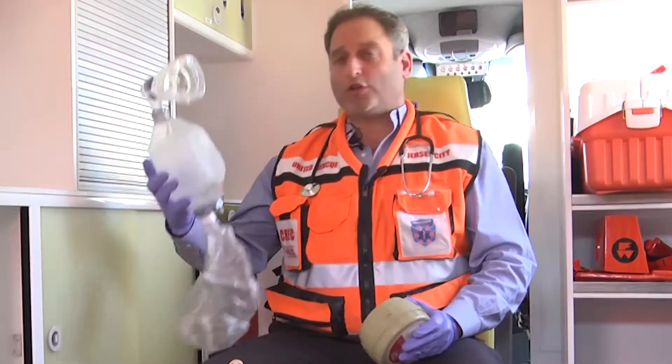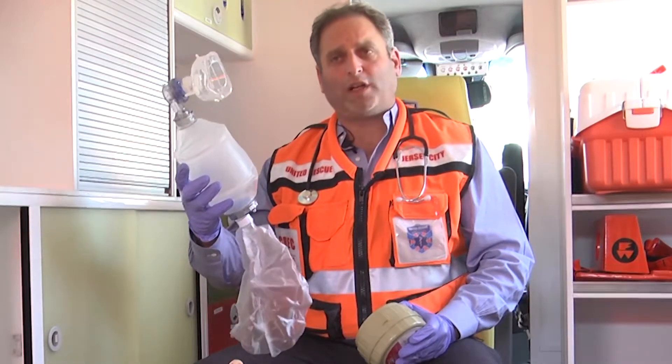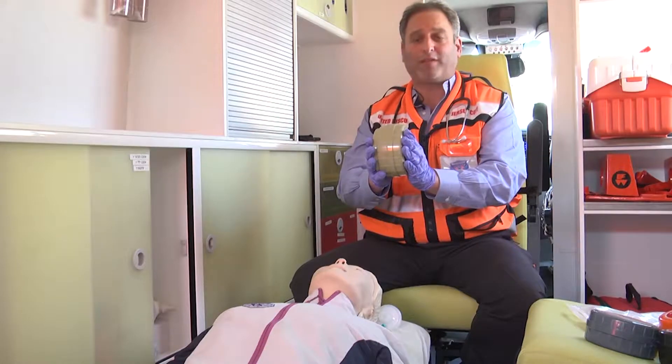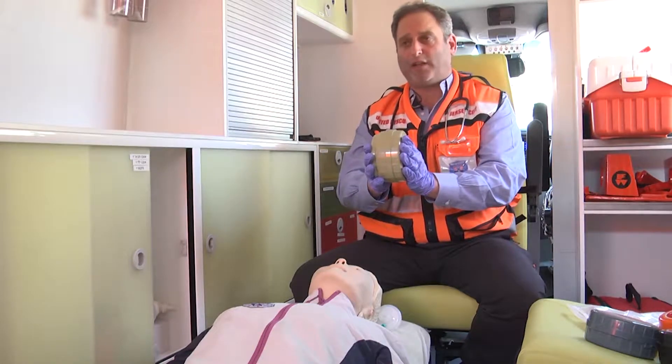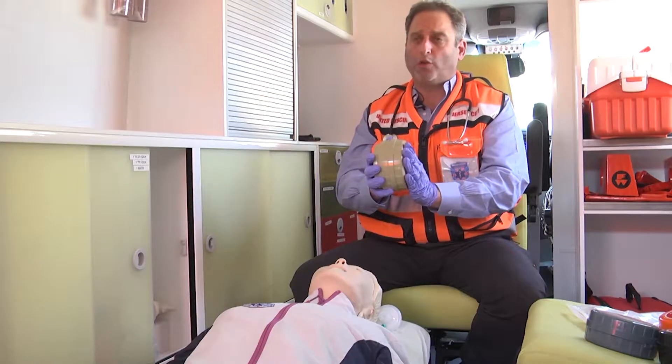We all know the standard BVM that we use for venting a patient, and we know that in the field it's very difficult to carry one of these because of its size, packaging, and how much room it takes up in our kit. This BVM is very unique in that it takes up very little space — about 75% less space — and can fit into any vest, kit, or anywhere else we want accessibility to a BVM.